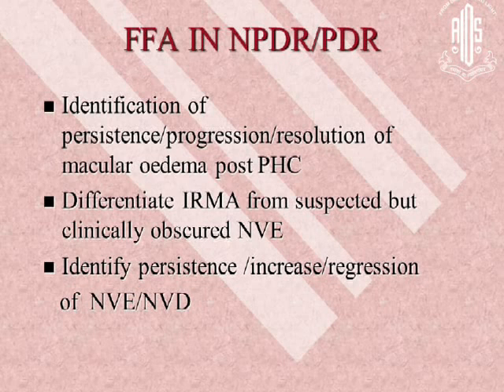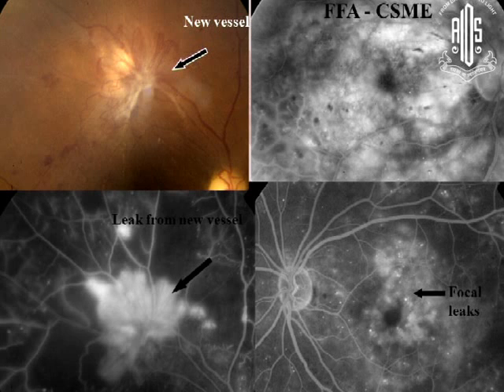What you treat by making a clinical diagnosis, you treat the very severe NPDR or PDR component with pan-retinal photocoagulation. But still, if you're not happy, or if there are some minor bleeds, you can always repeat an angiogram to notify whether there's any persistence or increase, or whether there is regression as well. This is one picture on the extreme left, where you see a big neovascular front with some fibrous proliferation which can't be missed, which is seen equally well on an angiogram.